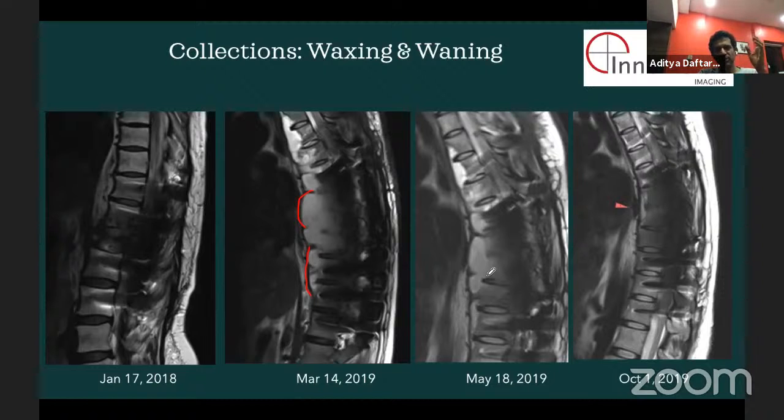But in these situations, because they are challenging, because you have the patient in the scanner, you will do everything, because later on you don't want to say, oh, now I don't have something to do. So very often you'll find the answer without contrast, and most often the contrast is not adding anything. But given the situation, given the decision, you want to make sure you cover all bases.